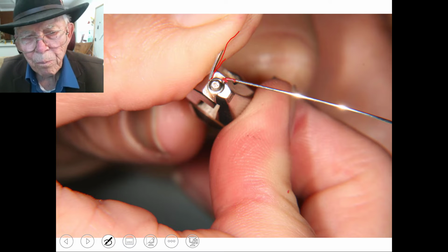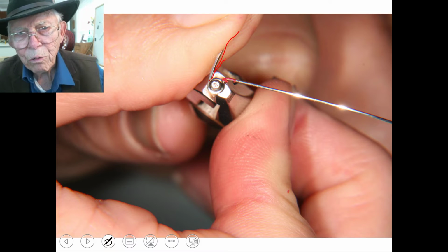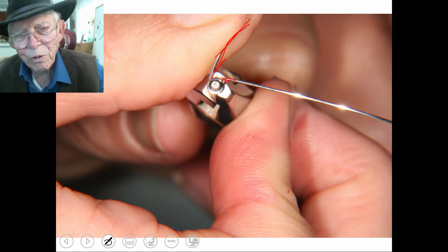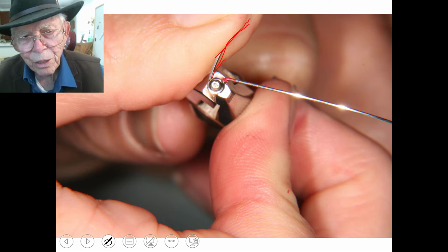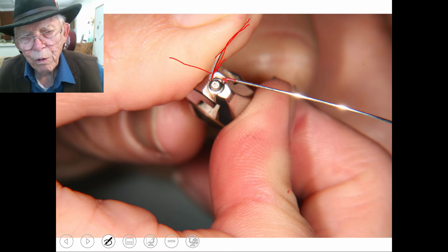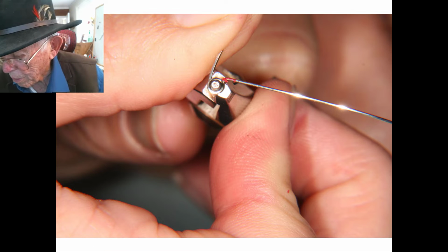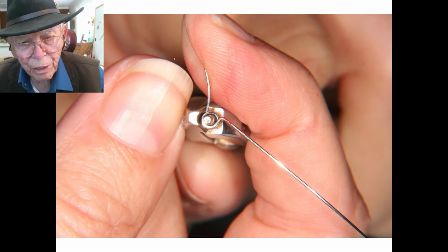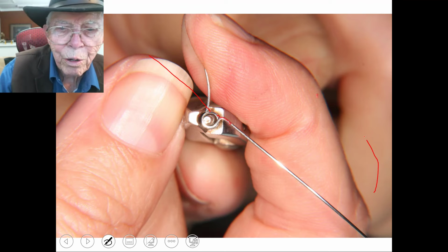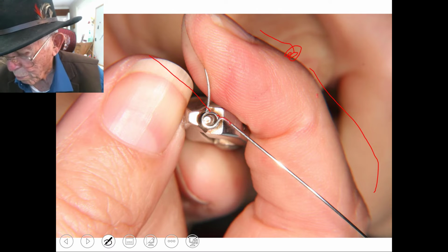Now you actually hold the wire with your plier, but you bend it with your fingers. I mean, you can see how this wire is embedded in the fingers as this person is closing that together where it'll stay straight up and down. Then he'll bend it back in that direction over a round surface in there. And let's get that out. And now we're going to bend it in a distal direction. Now this will be the tail end of the thing, and it'll go around and be up. We'll have to make another one of these over on that side of the mark of the plier itself.